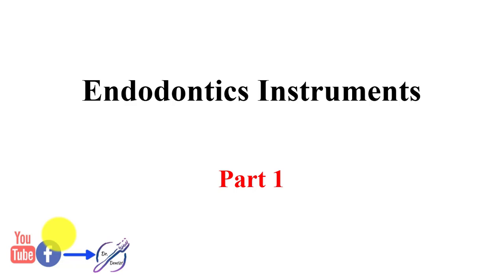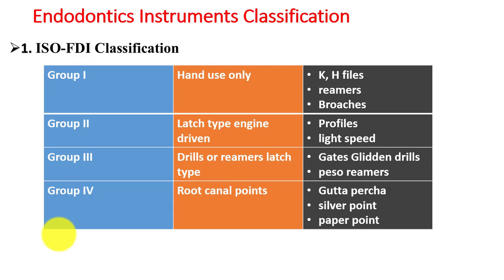Today I would like to talk about endodontic instruments. It has about 3 to 4 parts, and this is its first part. First, endodontic instruments classification. There are three endodontic instruments classifications.